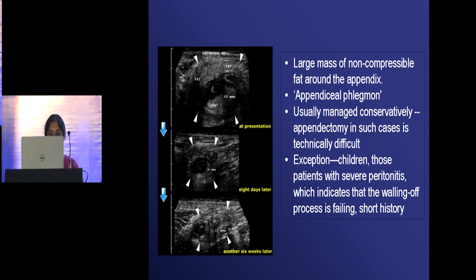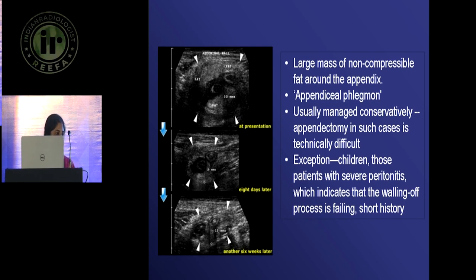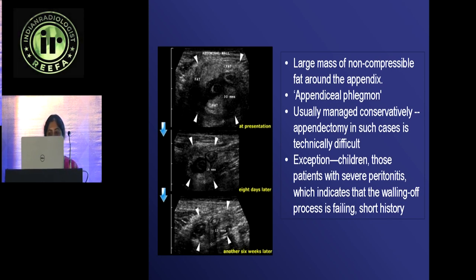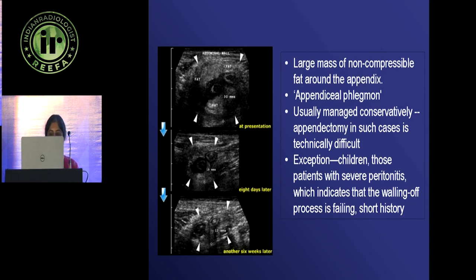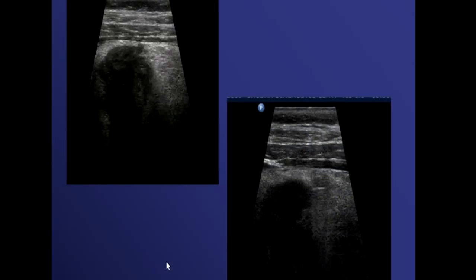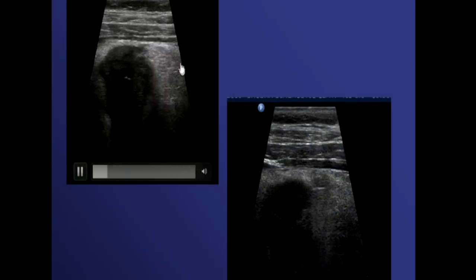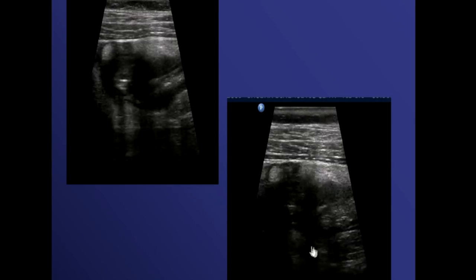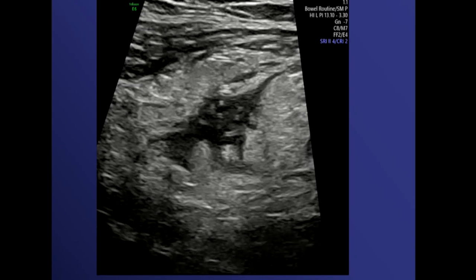An appendicular lump or phlegmon is a large mass of non-compressible fat around the appendix, usually managed conservatively because appendicectomy is technically difficult. Exceptions include children with severe peritonitis where the walling-off process is failing — those patients are operated to prevent septicemia. You see a fatty mass with clumped bowel loops and appendiceal inflammation. It is important to diagnose on ultrasound whether it is perforated, has formed a lump, or is just acute appendicitis.